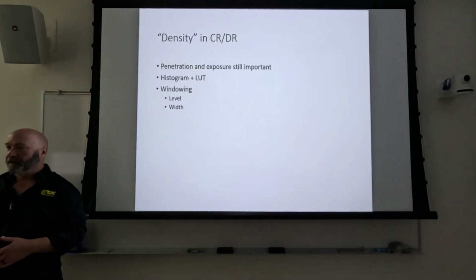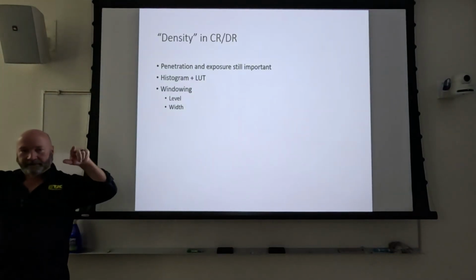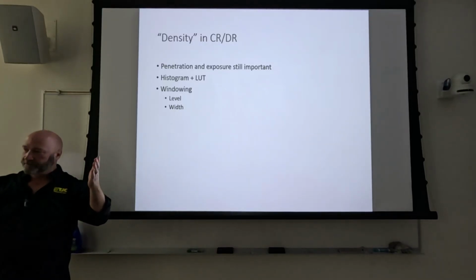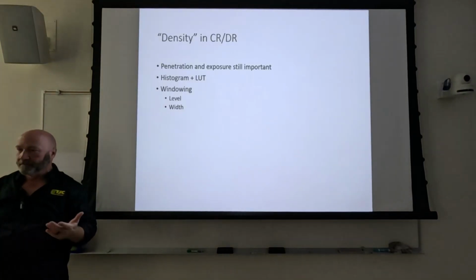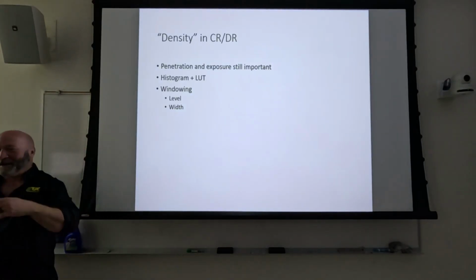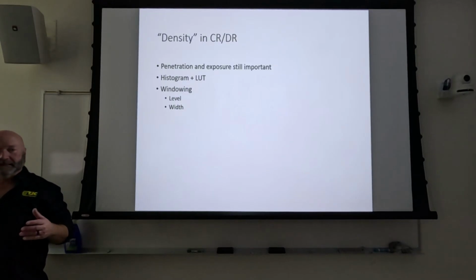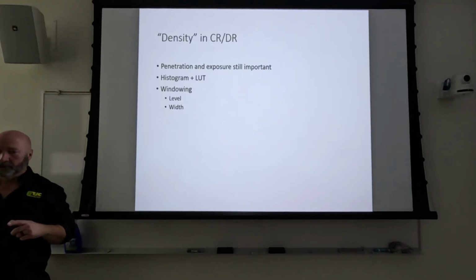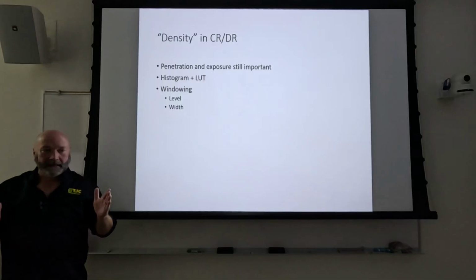compared to, right? So have y'all seen a histogram? A histogram is just a bunch of not squiggly, but straight lines. It's just on a graph that's kind of long, and it's got these vertical lines and then gaps in between them. There's some in the Bushong book. But what the automatic rescaling does is it takes those lines and you feed it your histogram. The histogram is your representation, those squiggly or pointed lines.